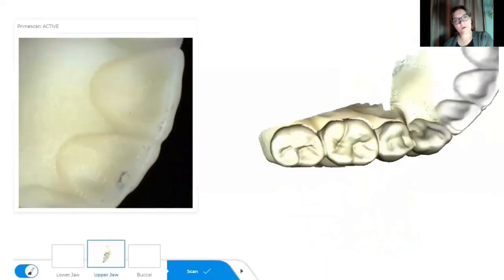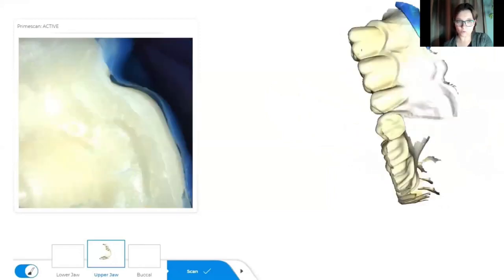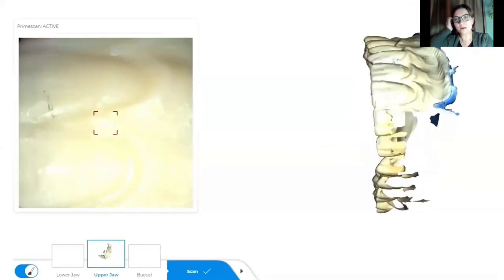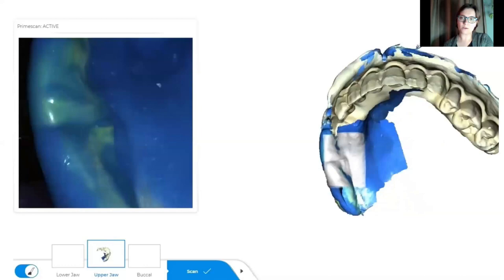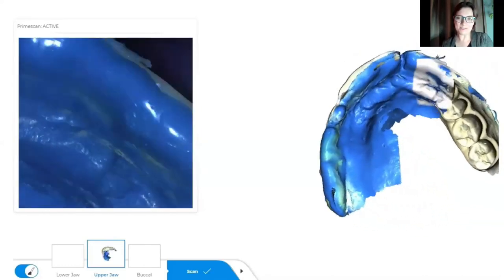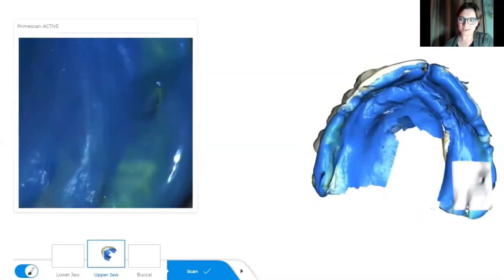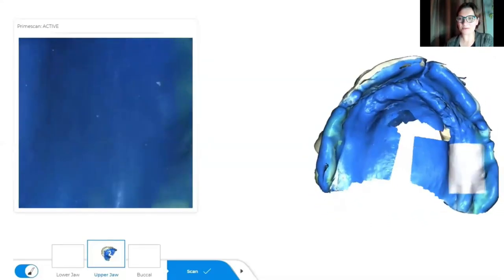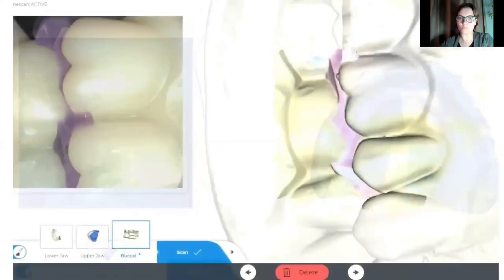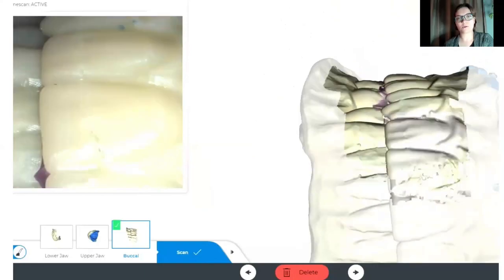Once you've made the changes you want, you can scan your denture. If you're doing a monolithic try-in, you can scan that as well. This is showing an intraoral scanner, just picking that up with a hand scanner. Again, this time I started with the teeth and then rolled onto the impression. We were doing kind of a study to see which one was the most accurate, and we did find that it's easier to roll from the impression to the teeth. Then you can scan your interocclusal record as well.